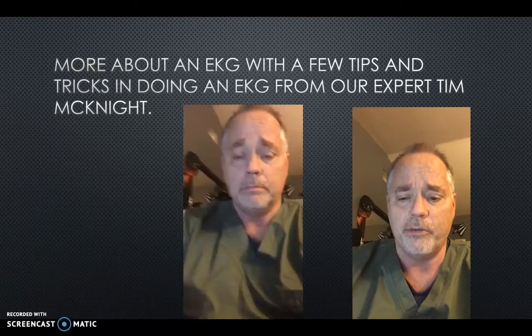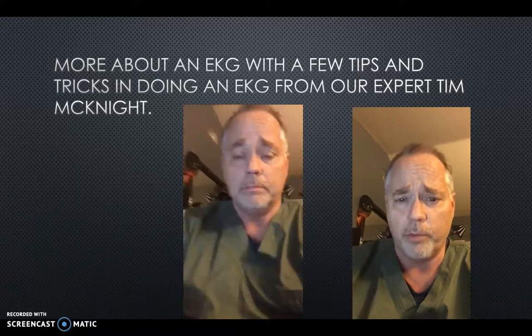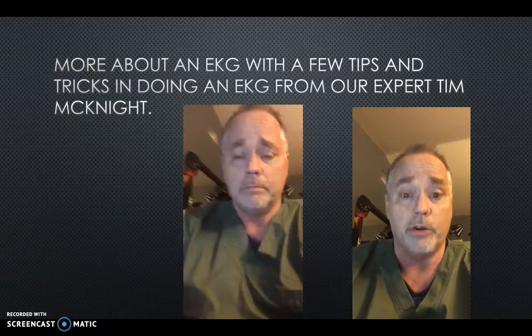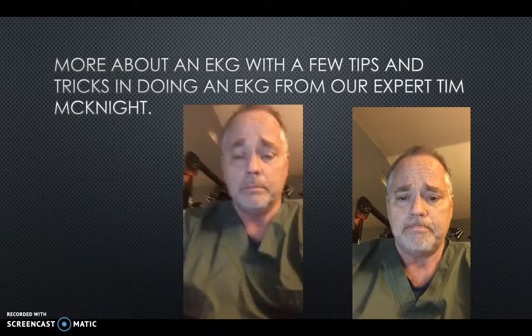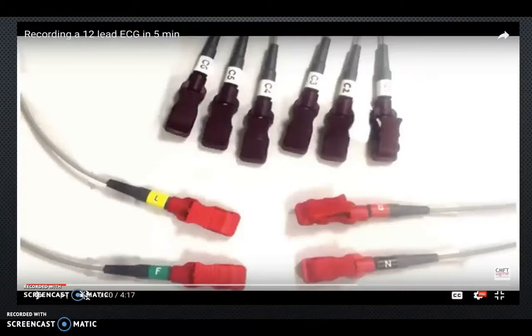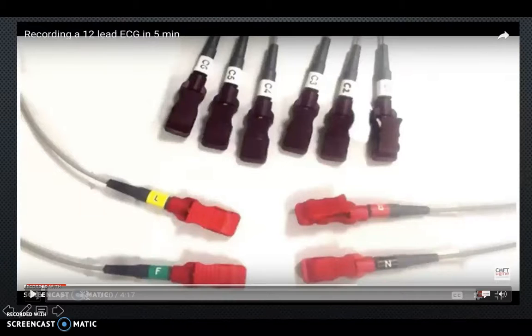So that's to help with the motion artifact. And prior to acquiring the EKG, you just want to always check the quality of your tracing on your screen prior to acquiring. Now, we'd like to thank Tim for some of his expert tips and advice. And now we'd like to move on to how to specifically do that EKG.